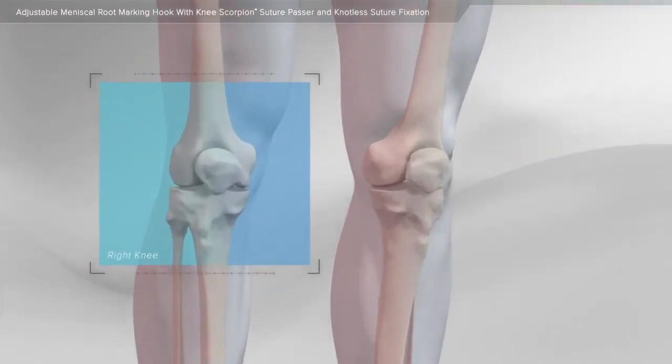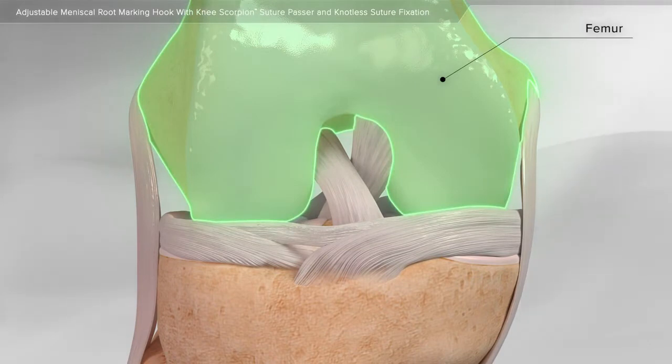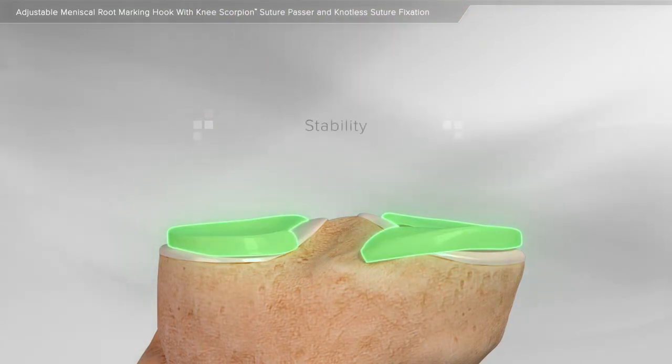In this animation, we will show a meniscus root repair in the knee. The meniscus is a gasket-like structure in the knee that sits between the femur, or thigh bone, and the tibia, or shin bone. The meniscus acts as a shock absorber and adds stability to the knee.